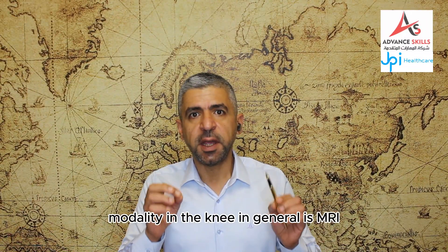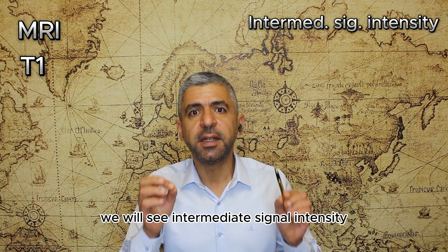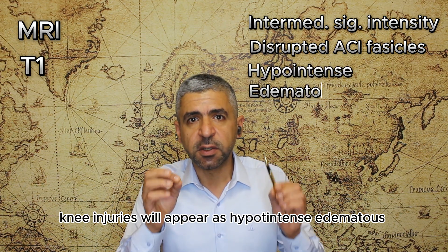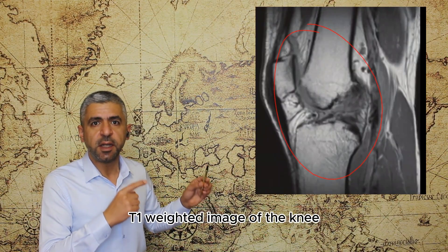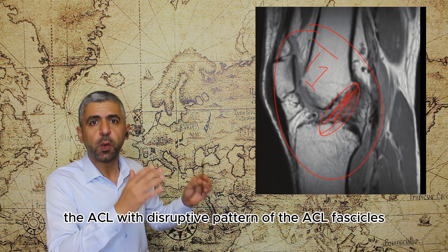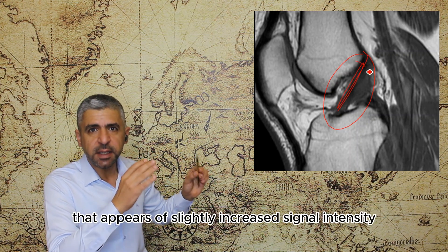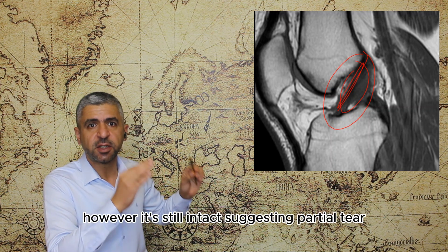The best imaging modality for the knee is MRI. On T1-weighted imaging, intermediate signal intensity is seen with a disrupted pattern of the ACL fascicles. Bone injuries appear as hypointense edematous contusions with or without non-displaced fractures. For example, on this T1-weighted image, intermediate signal intensity replaces the ACL with a disruptive fascicular pattern. Another example shows slightly increased signal intensity with disrupted but still intact fascicles, suggesting partial tear.